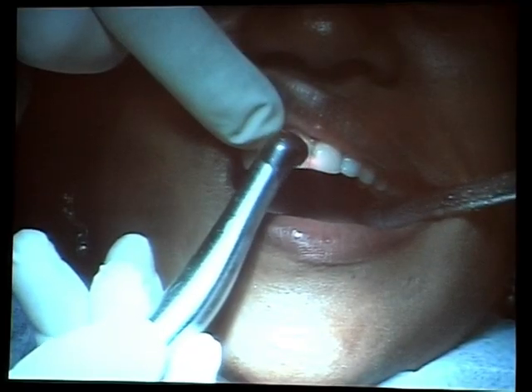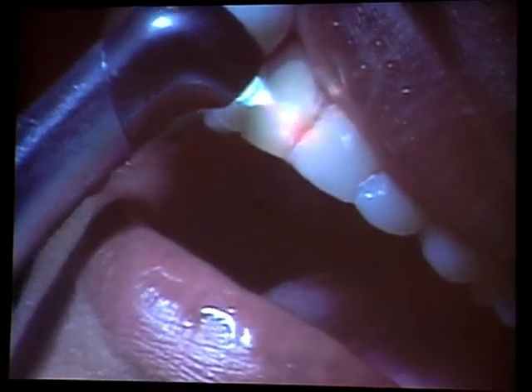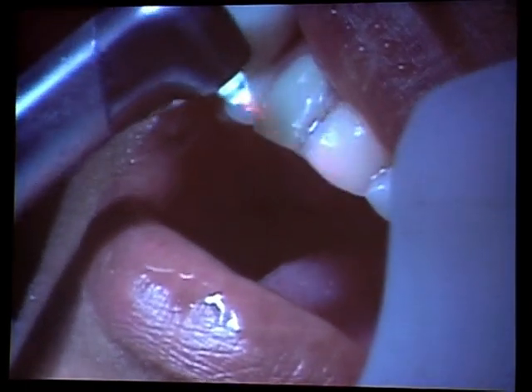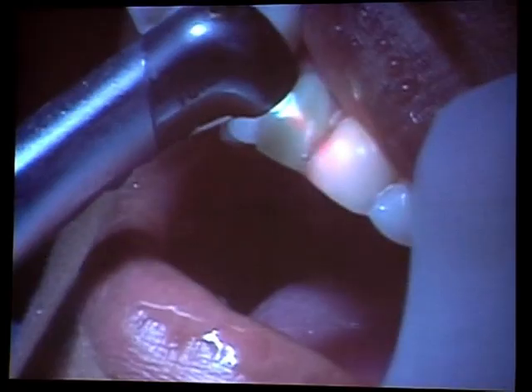Can somebody ask the patient if she's feeling any sensation, Ralph? Beg pardon? Can we ask the patient if she's feeling any sensation? Good. Normally there will be no pain.